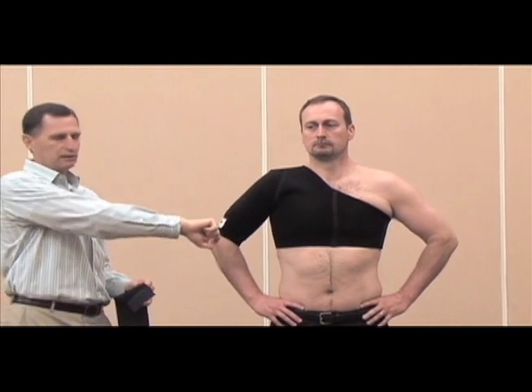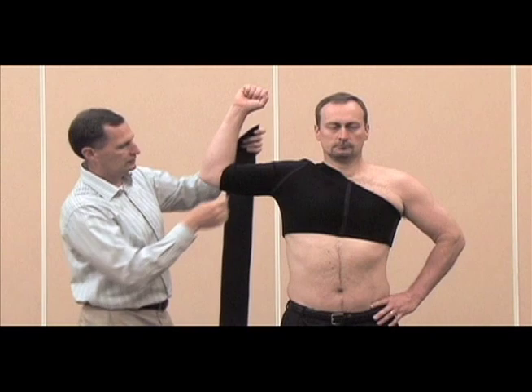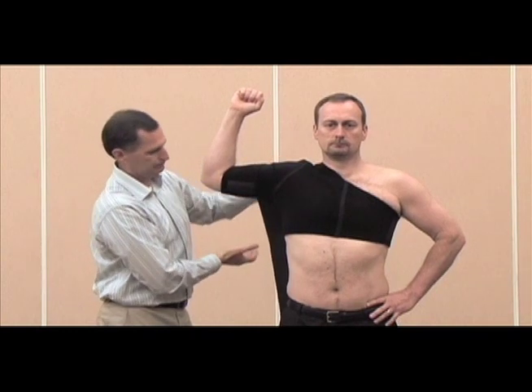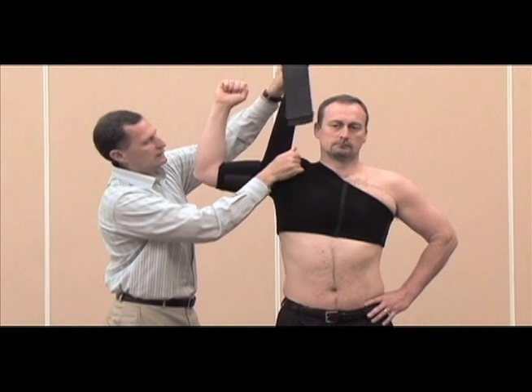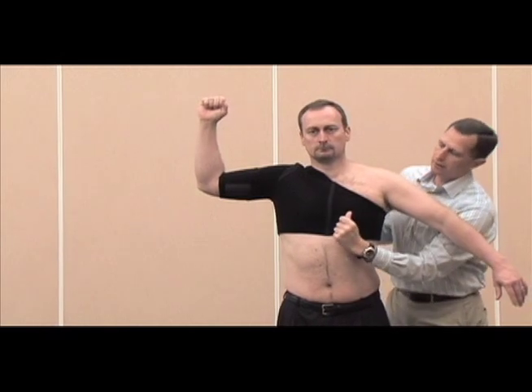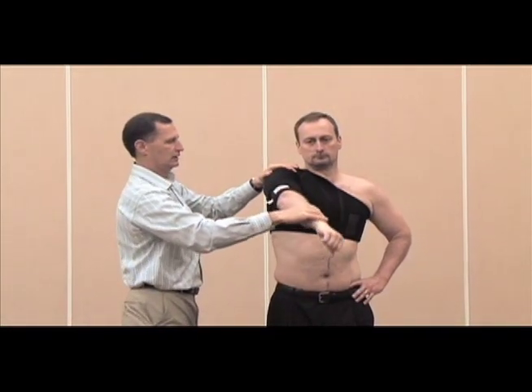For posterior instability, we want to try and keep the athlete out of horizontal abduction and internal rotation. Start them externally rotated and abducted to about 90 degrees. Apply the strap just below the front of the bicep, come around the arm one time, through the armpit, take the stretch out of the strap over the top of the shoulder, and out to the opposite shoulder. This is to prevent horizontal abduction and internal rotation.